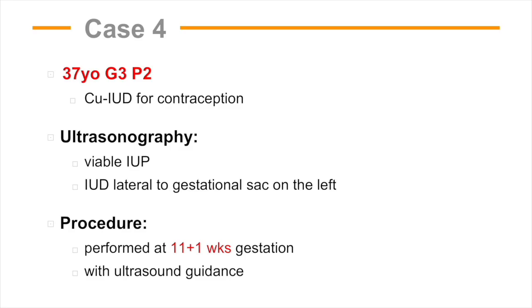Case 4 is a 37-year-old Gravida 3 Para 2 who had a copper IUD removed at 11 weeks and 1 day under ultrasound guidance. This case nicely depicts how the uterine cavity is entered slowly and carefully to avoid disrupting the gestational sac, which is now seen here. Minimal distension media is again used to create a track between the sac and the lateral uterine wall. The hysteroscope is angled up and over the gestational sac before returning to the track against the lateral uterine wall when the IUD is not seen.